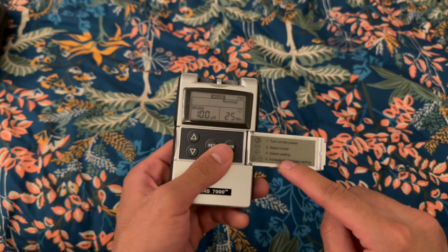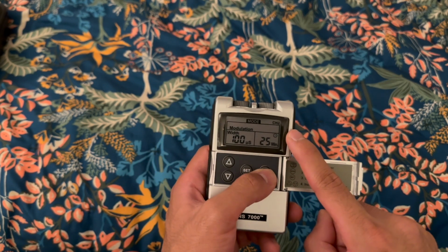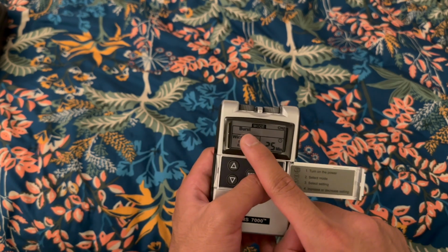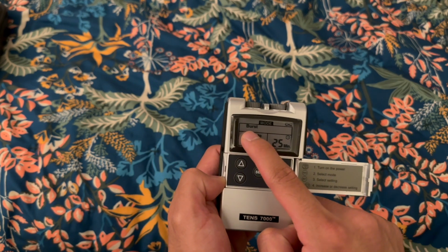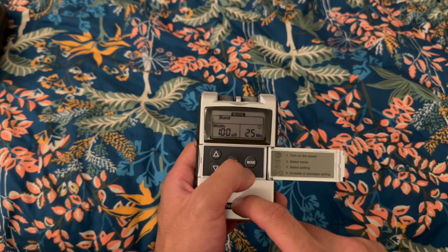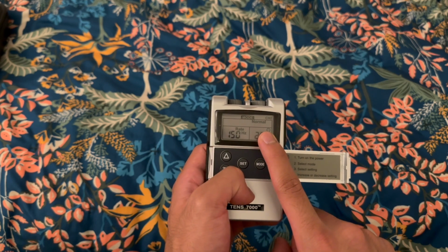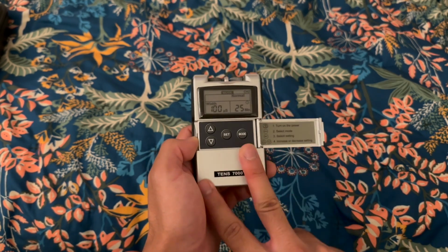So I'll touch on the mode sources right now. Right now we're on normal. We have modulation, SD1, SD2, and a nice one that comes with this device on the TENS 7000, burst. We'll touch that for a specific modality that we can use using this device. But for right now, let's go ahead with normal. This is where we're going to see different settings for conventional TENS and acupuncture TENS.